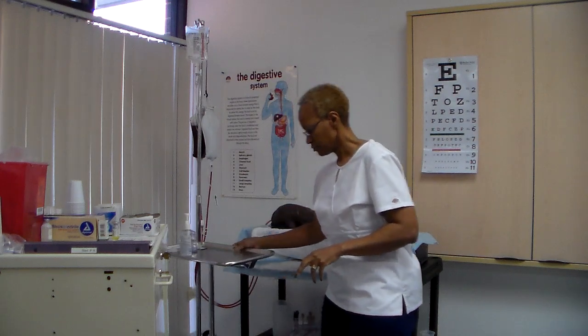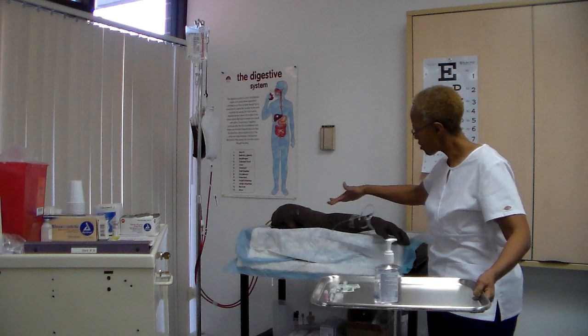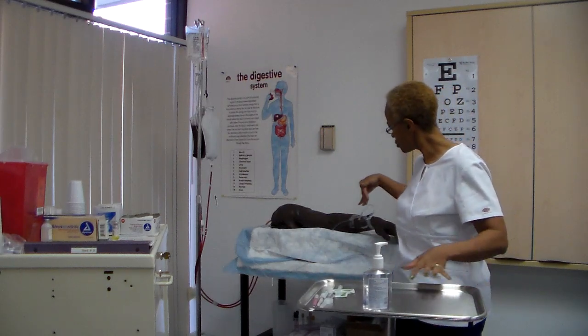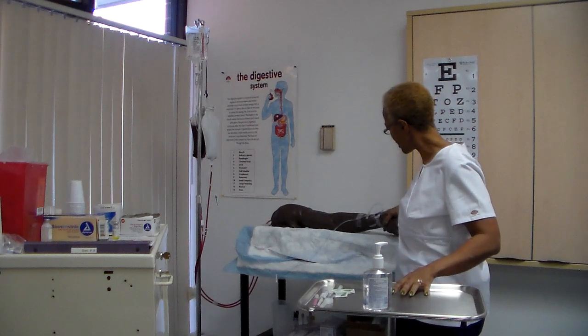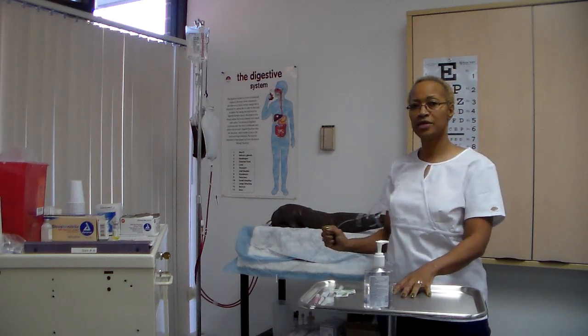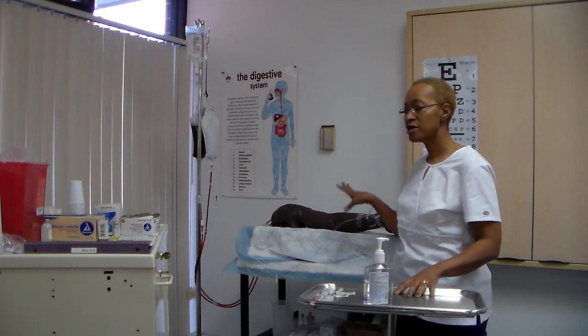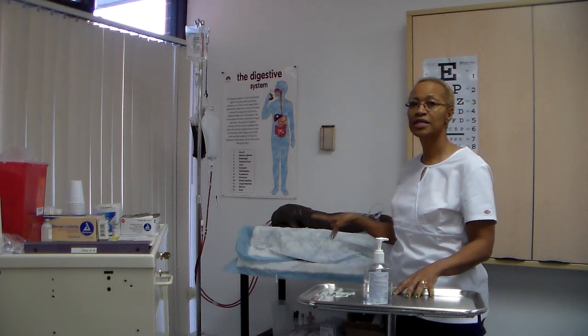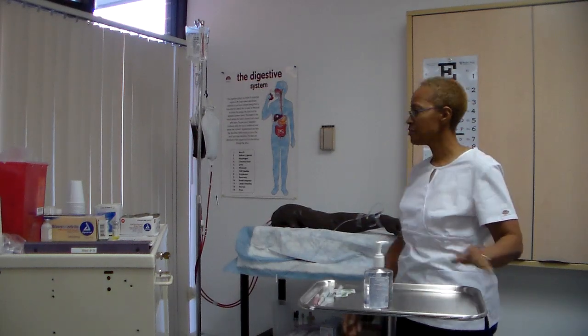Okay. So you're going to look for any reaction. So look at their arm. Make sure their arm looks good. There's no redness going up the vein. There's no phlebitis or anything like that. So make sure you do that initial assessment because you're going to go and document that. Now, if you come back in an hour and, oh my goodness, now they have this red spot, you know that they're having an allergic reaction to the medication. So again, your initial assessment is vital. All right, I'm going to be back to check on you in about an hour.